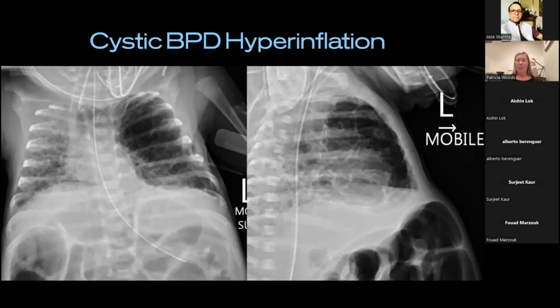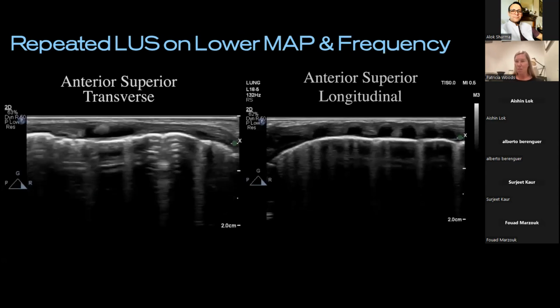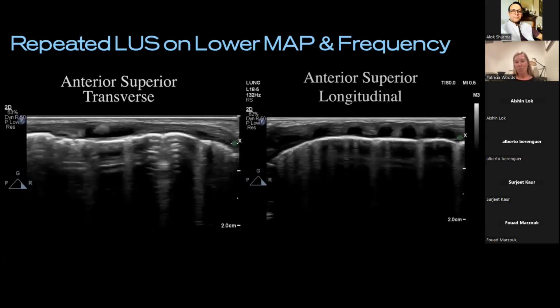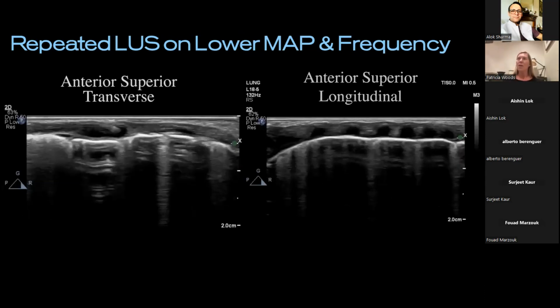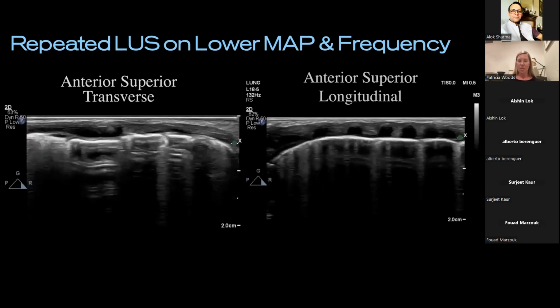So clearly, thankfully, we asked our team to put the needle down and let's come forward and decompress. And you can see the concerning gaseous distension you've got going on, pushing everything up as well. And this is the appearance as we started to slowly drop that mean airway pressure, starting to decompress a little bit, and in longitudinal plane looking a little happier. Okay, so again, I know there's not a lot of reports out there about the hyperinflation, but I think it does have a role sometimes, and just putting it in clinical context in this space.